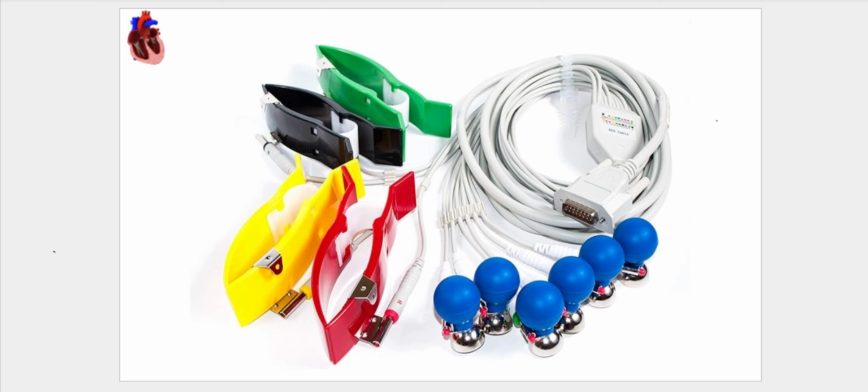These are the leads that are normally in contact with the body to pick the particular electrical signals, which are then relayed to a monitor through this wire connection, almost similar to a VGA. From a single lead, we expect specific information about the heart to be relayed.